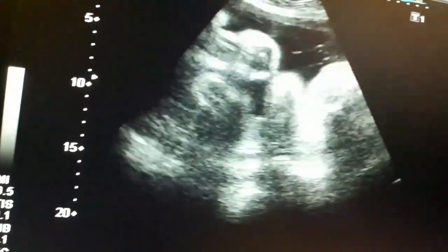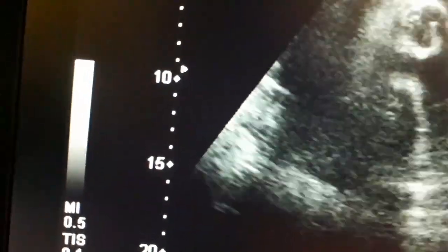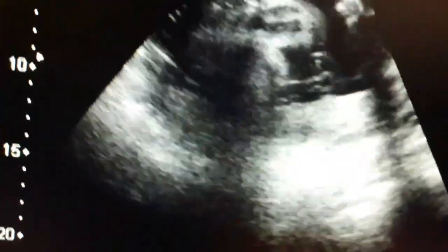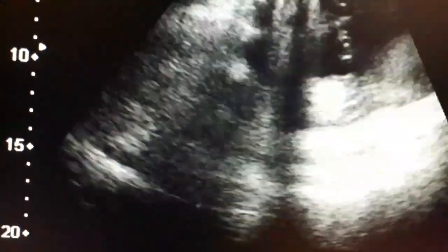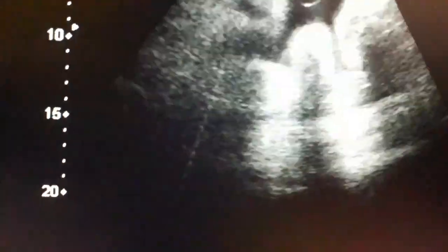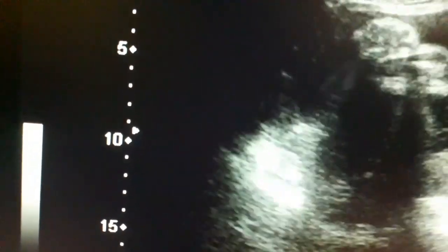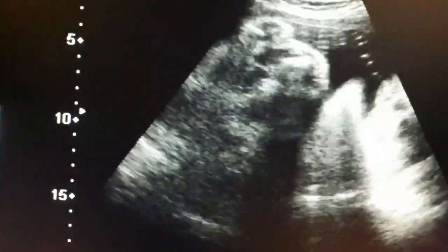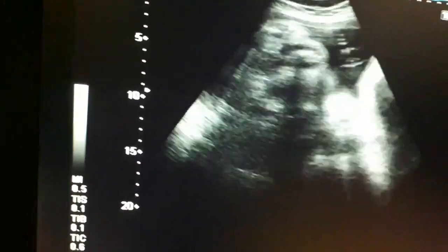You can appreciate the placenta and the lining between the uterine wall and the placenta. You can put on the Doppler color and appreciate the separation of the placenta from the uterine wall.